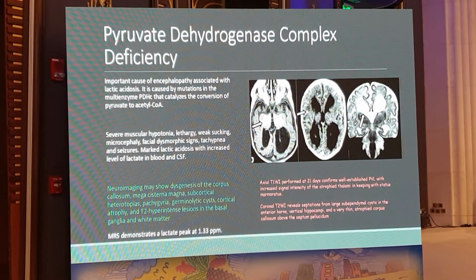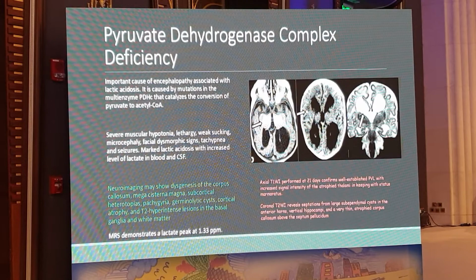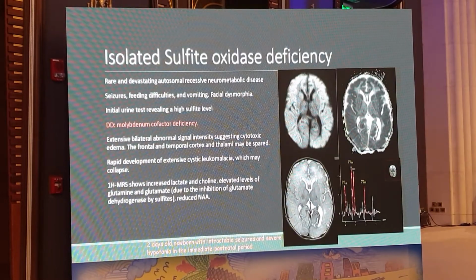It can show distorted lateral ventricles with internal septations, abnormal signal intensity, and sometimes calcification. If the patient has an early scan, like an ultrasound, antenatal scan, or fetal MRI, it can also show the brain already affected.